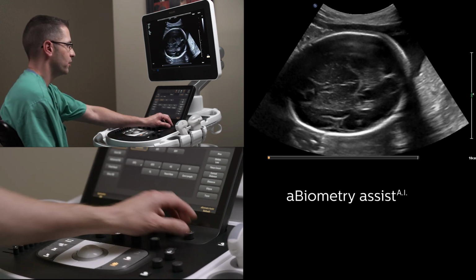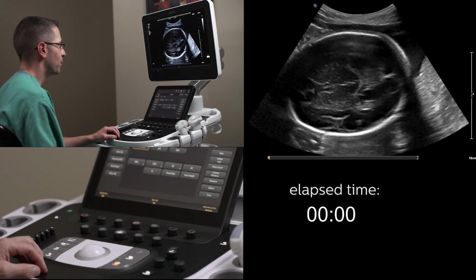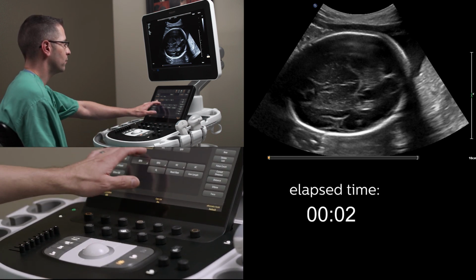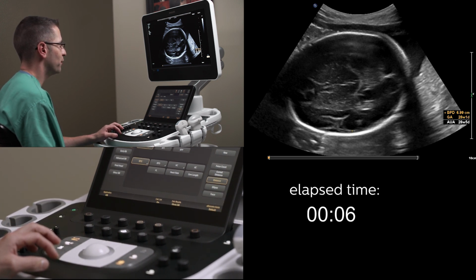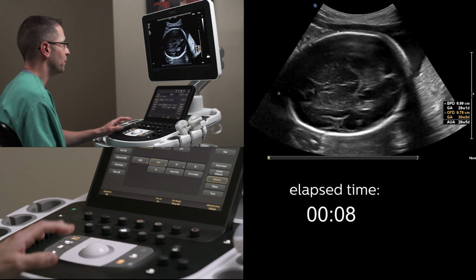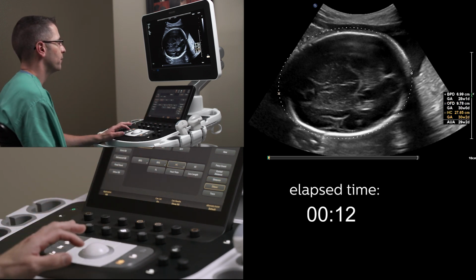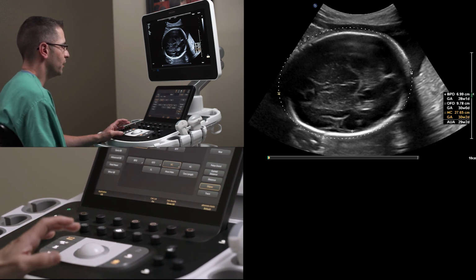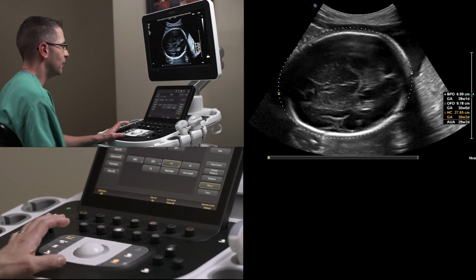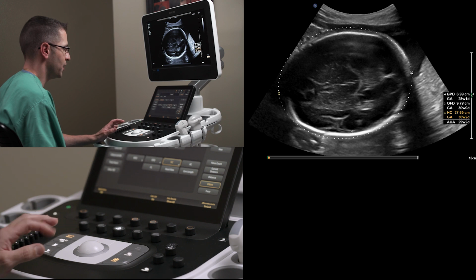And so we're going to turn that on. And again, I'd like to measure the biparietal diameter. I'm going to push one button. I'd like to measure the occipital frontal diameter. I'm going to push one button. I'd like to measure the head circumference. And the head circumference is measured with the tool, using simply pushing the button and not adjusting anything with the left hand, as the anatomical intelligence identifies the structures that we need.